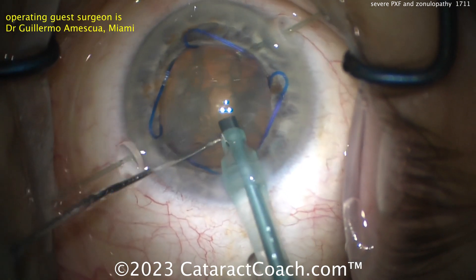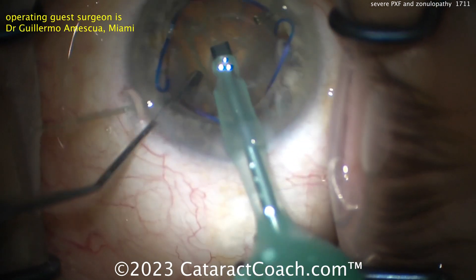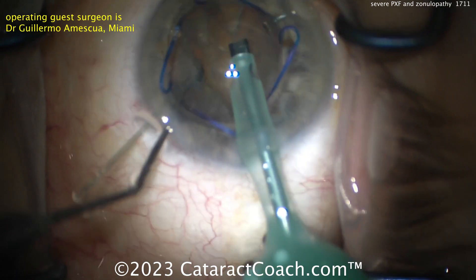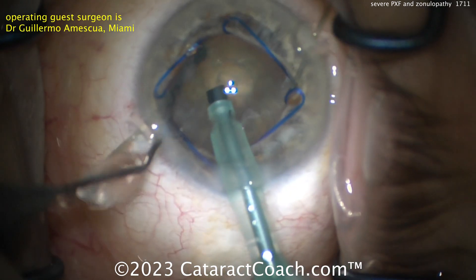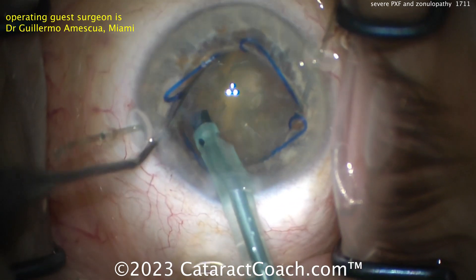There's the nucleus and you can see the whole thing just kind of wants to move. This is a case where maybe you don't want to rotate it too much, but rather just get the pieces split and bring them up — get them out of the capsular bag. Very weak capsular bag. This is, of course, a very tricky case.